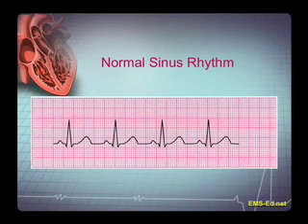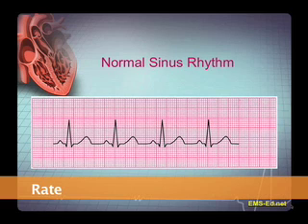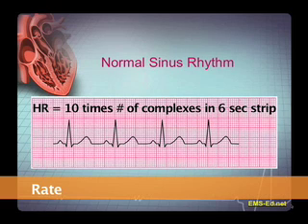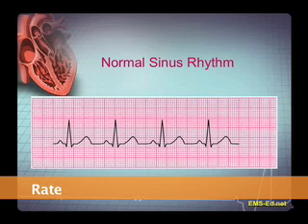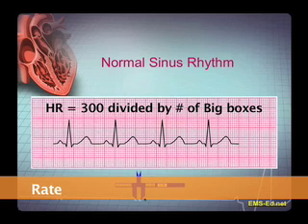Before we know what is abnormal, we need to know what is normal. Let's be systematic. First, what is the rate? We could count the number of complexes in a 6-second strip and multiply by 10 to get our heart rate. But this is not a 6-second strip. No problem — count the number of big boxes between R waves, divide that number into 300, and that is the heart rate.